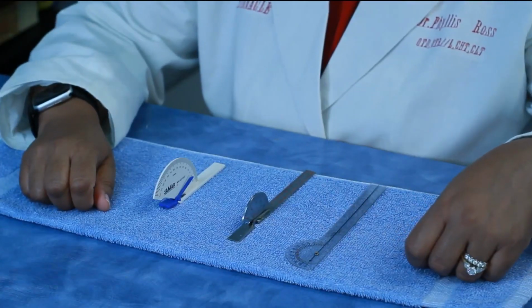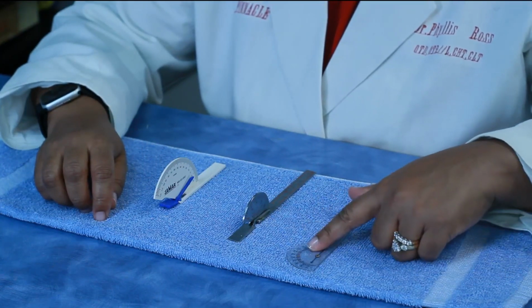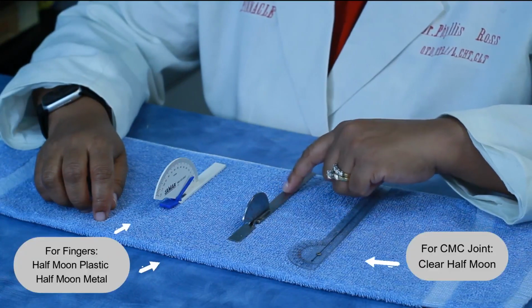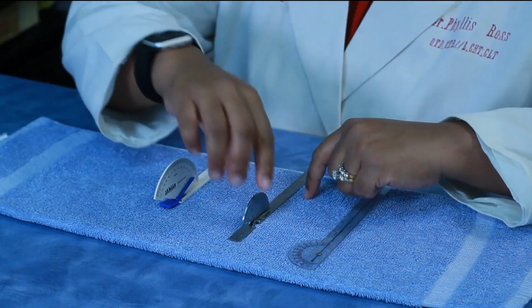So we're talking about goniometric measurements. The three devices here in front of me are the ones that are going to be necessary to measure the thumb. This is an option for the fingers. I don't use it a lot, but wanted to share it. And then this is another device, the one that I technically commonly use for measuring the digits.